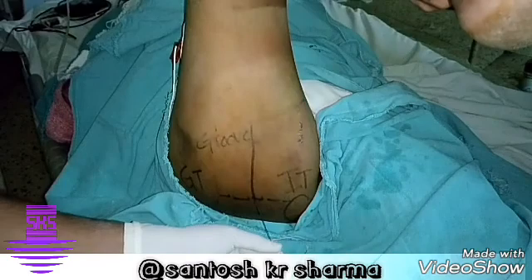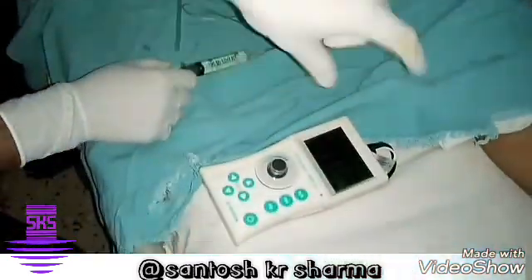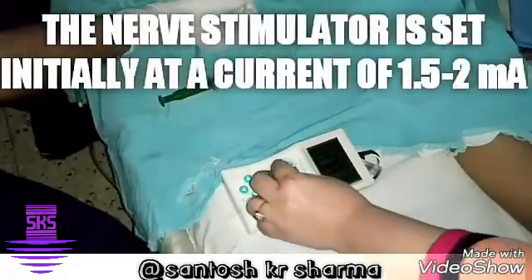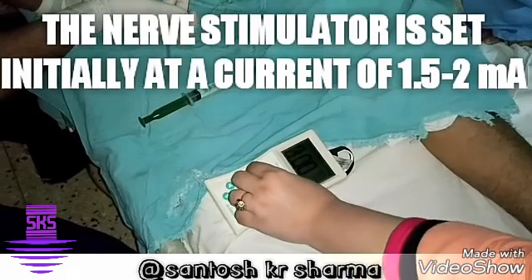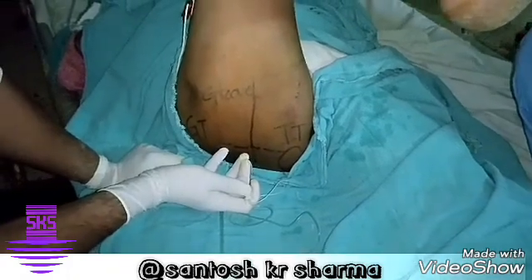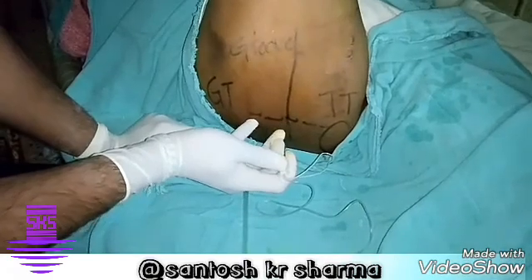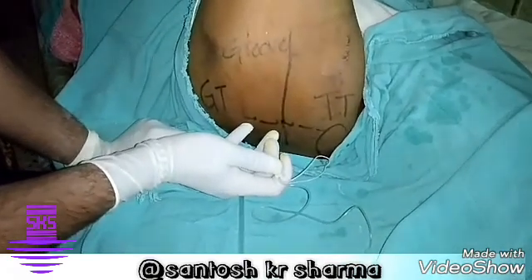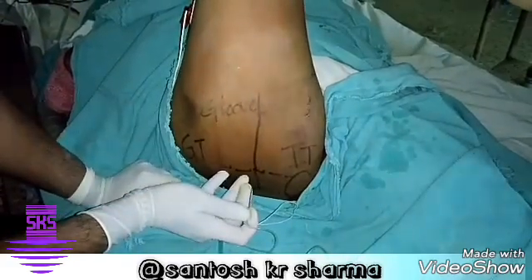We have taken a 10 centimeter long Stimuplex needle and peripheral nerve stimulator, set at 1.5 milliamps. The point of entry has been marked. What we do is go perpendicular to the skin and try to elicit a response which can be a plantar or a common peroneal response.